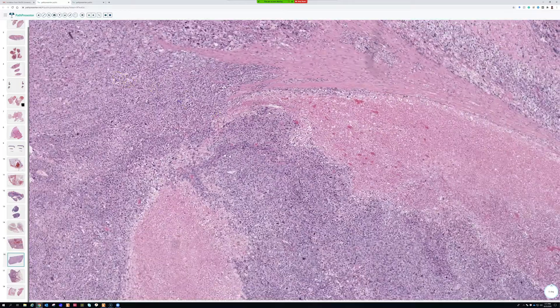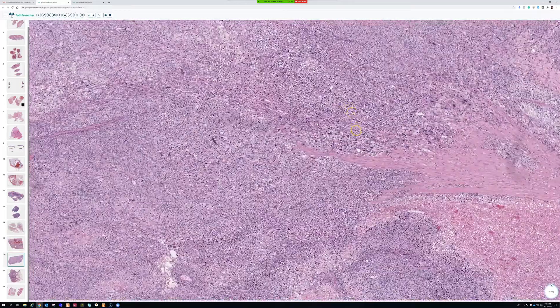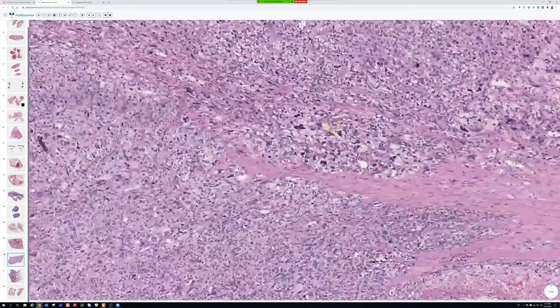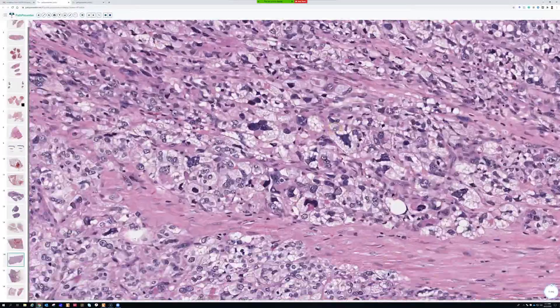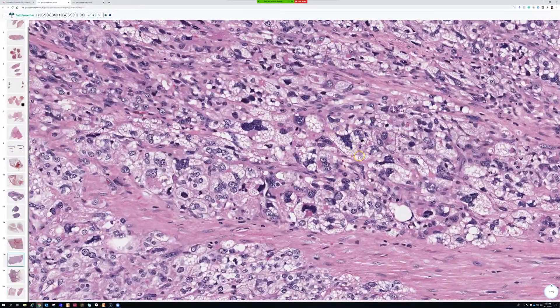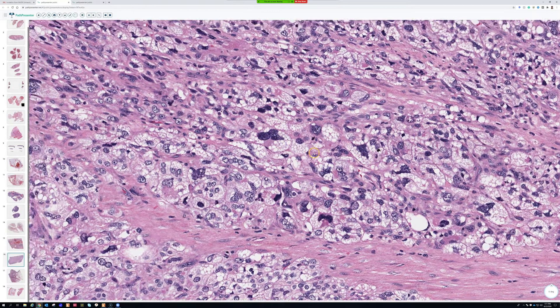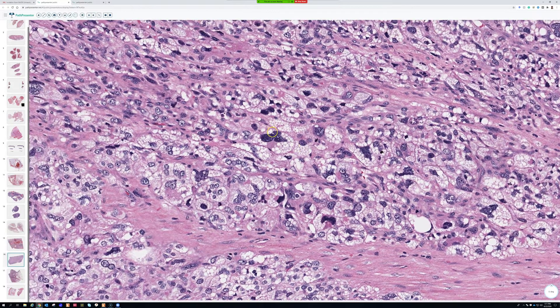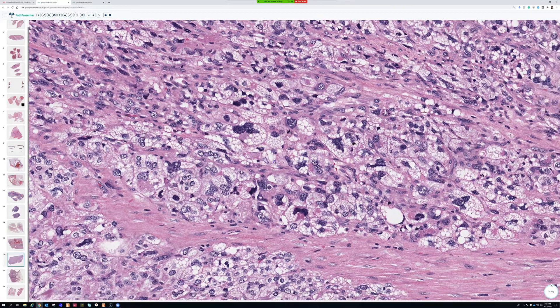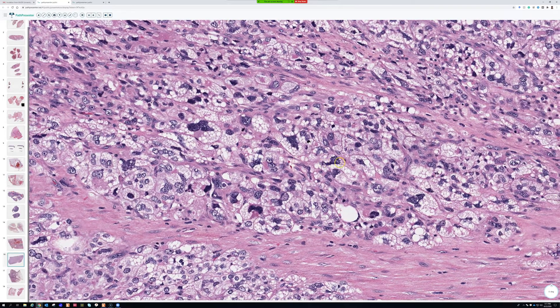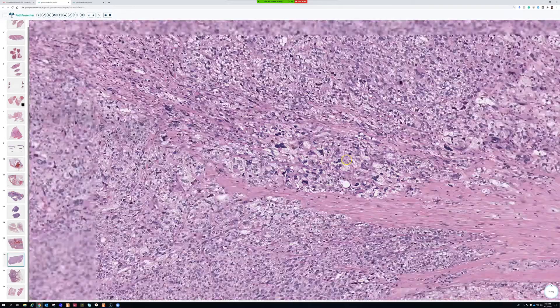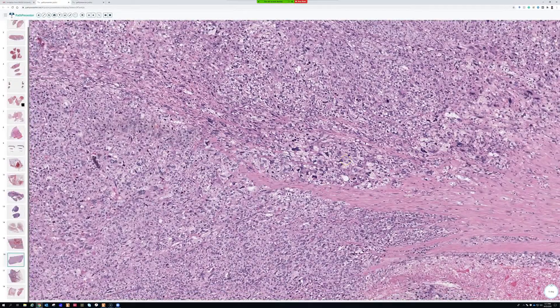There's a good area with really good lipoblasts here. That's textbook — the perfect lipoblasts with clear vacuoles pushing in on the nucleus and denting it. An important thing to remember: pleomorphic liposarcoma is the one liposarcoma where you must have at least one pleomorphic lipoblast to make the diagnosis.